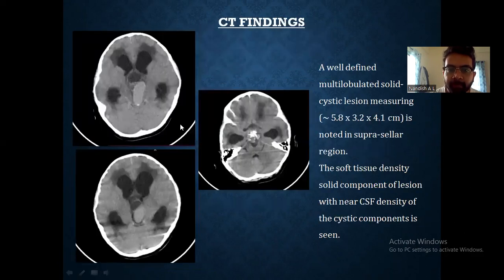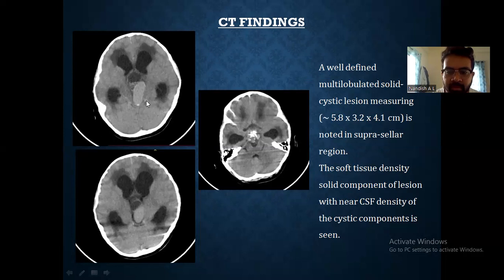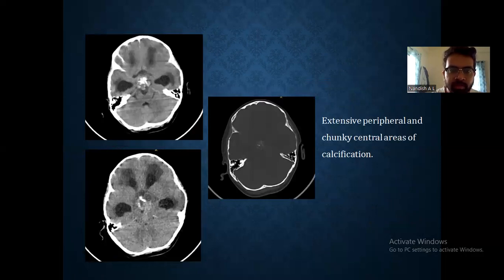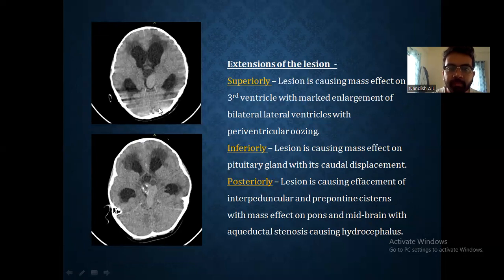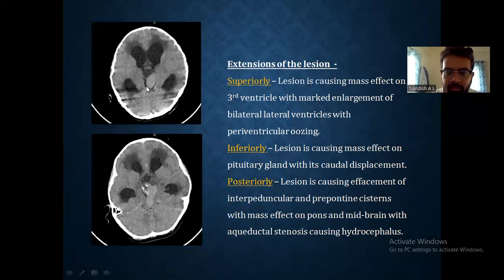Coming to the CT findings: a well-defined multi-lobulated solid cystic lesion measuring 5.8 x 3.2 x 4.1 cm is noted in the suprasellar region. The soft tissue density component of the lesion and the cystic component are noted, along with extensive peripheral and chunky central areas of calcification. Superiorly, the lesion is causing indentation on the third ventricle with marked dilatation of bilateral lateral ventricles with periventricular seepage. Inferiorly, the lesion is causing mass effect on the pituitary gland and its caudal displacement.